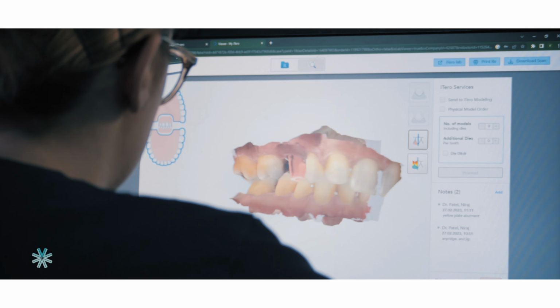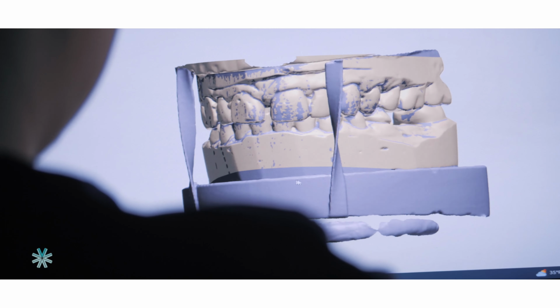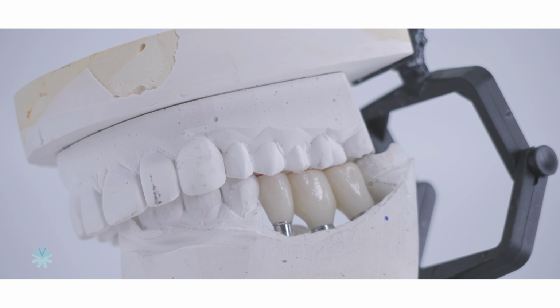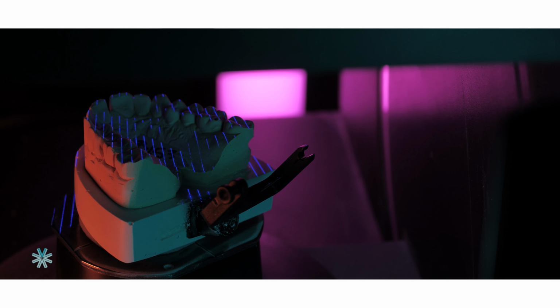If a doctor scans the scan body directly in the patient's mouth and they know that it's fully torqued in and seated, then they're cutting out all those steps in the stone models, the PVS impressions, making sure it's properly engaged all the way. You're eliminating those variables, so inherently scanning is more accurate. The difference in the workflow is you're basically just starting out digital, or we're going analog, traditional method, and converting it to digital in the lab.